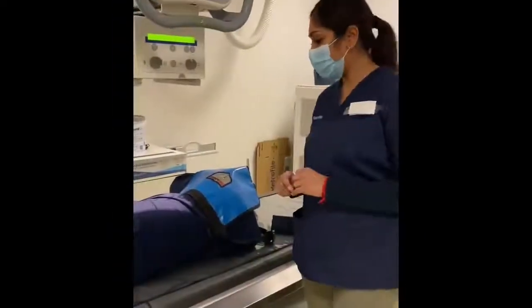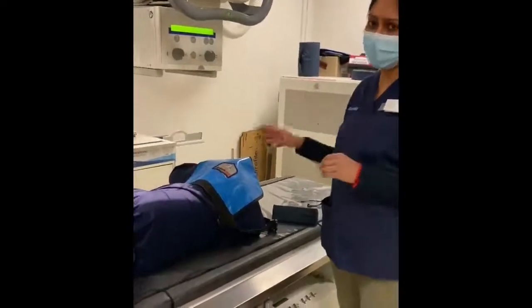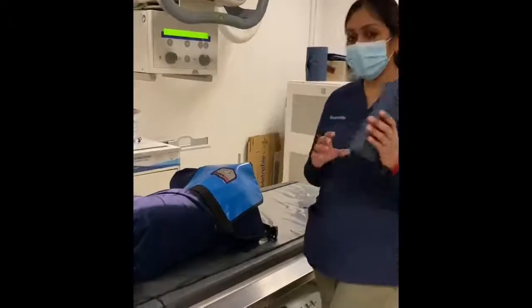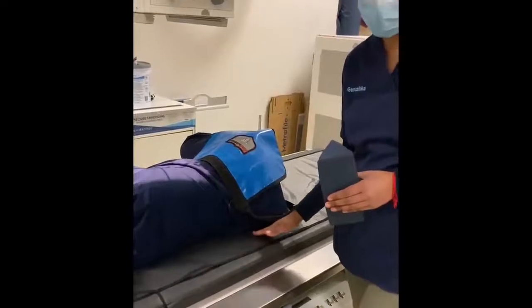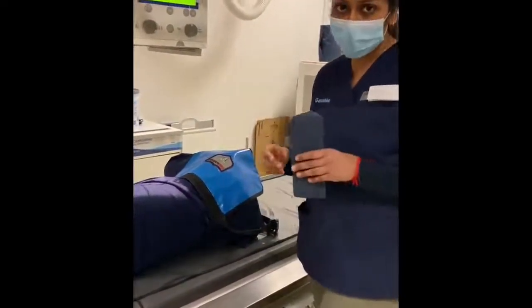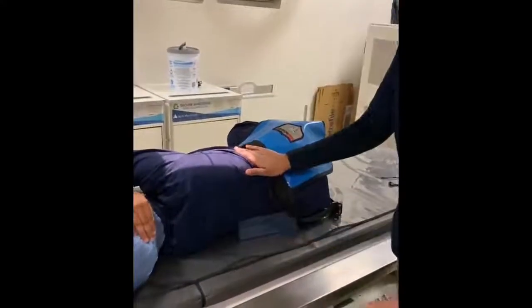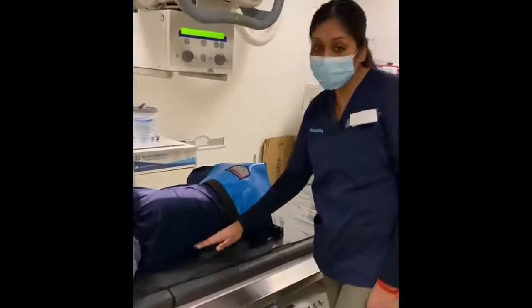Okay, so the other thing is just to remember, you still need to use your lead protection for both your AP and lateral views. And then to improve the image quality of your picture, you can actually use a little sponge which you can place at the curvature of the hips or the waistline. So this is more familiar in your female patients. In this case, you can just push the sponge in that way, you can relax. And this just sort of reduces the curvature of your spine again.